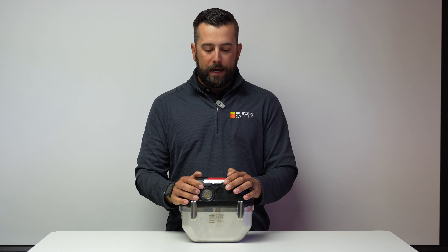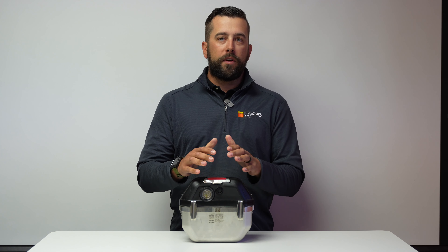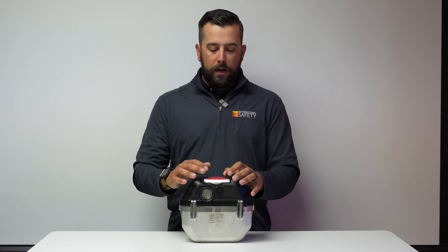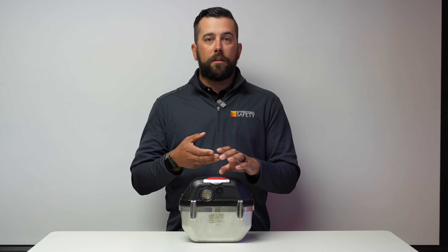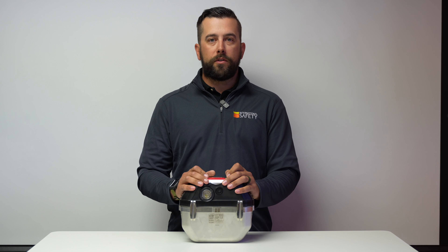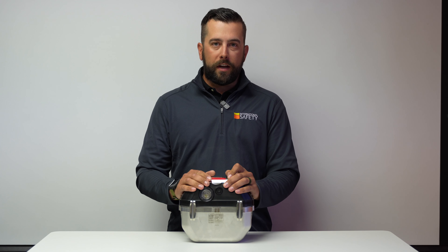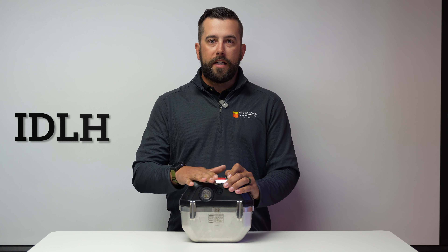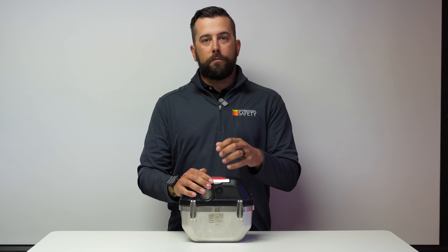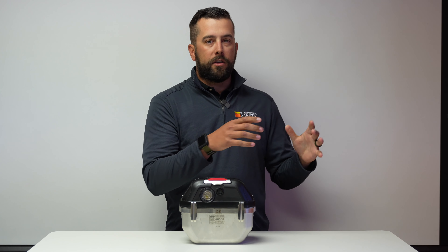This is an Oxy 6000. The Oxy 6000 is also available in the Oxy 3000 model. The difference between the two is your 3000 is going to provide you 30 minutes of escape oxygen, whereas your 6000 is going to provide you 60 minutes. When you want to use this is if you're in a confined space, a tunnel, or a mine, and there's a hazard — a fire underground or a gas leak of some sort — and that breathing air becomes immediately dangerous to your life and health. We call that IDLH. This unit is actually going to turn your exhale breath back into oxygen that you can breathe back in, in a low-profile configuration rather than having a full SCBA hanging on your wall.